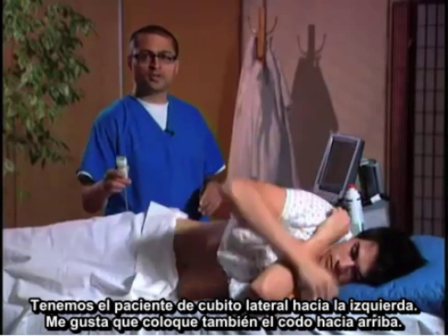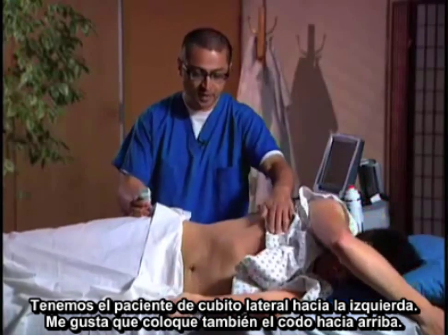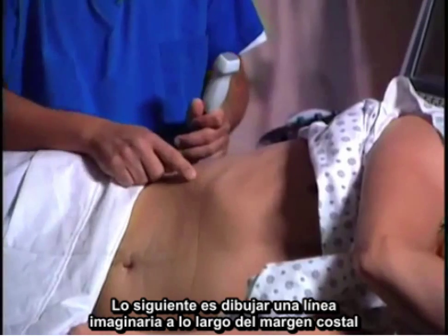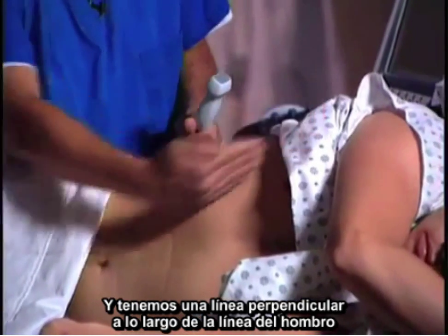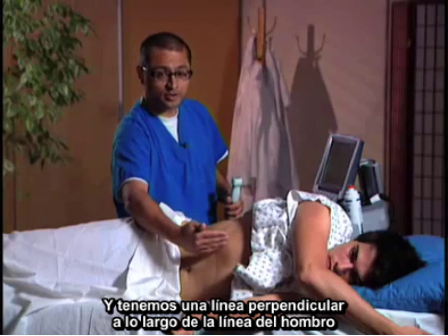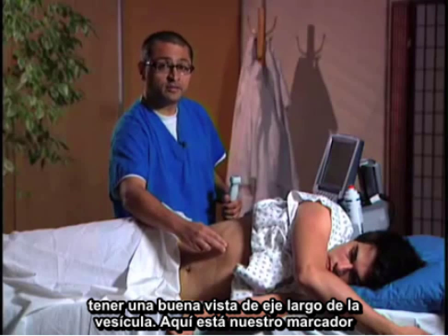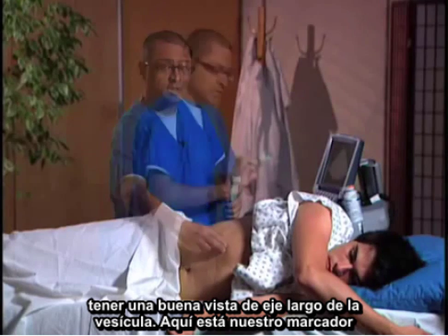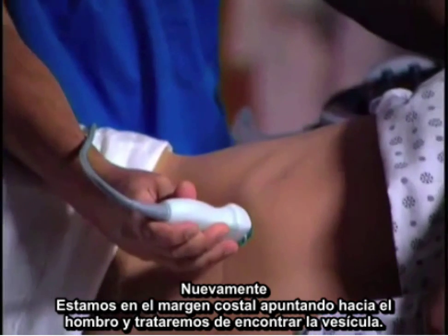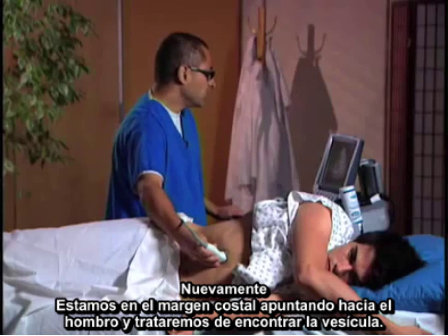Have the patient turn to the left lateral decubitus position with their elbow up. Next, draw an imaginary line along the costal margin and an imaginary perpendicular line along the line of the shoulder. Place the transducer right in that area and you should get a nice long axis view of the gallbladder. The transducer marker is pointing toward the shoulder at the costal margin.